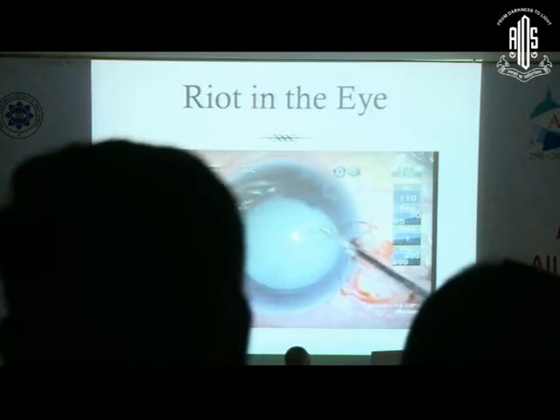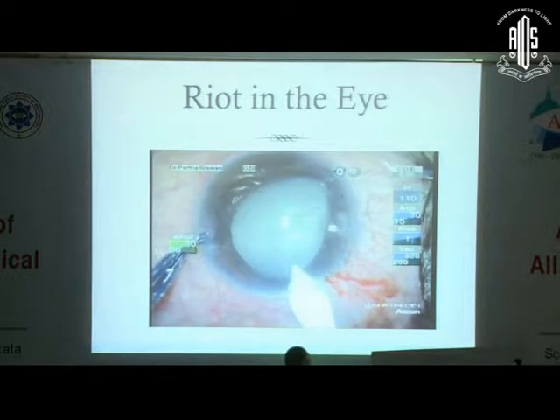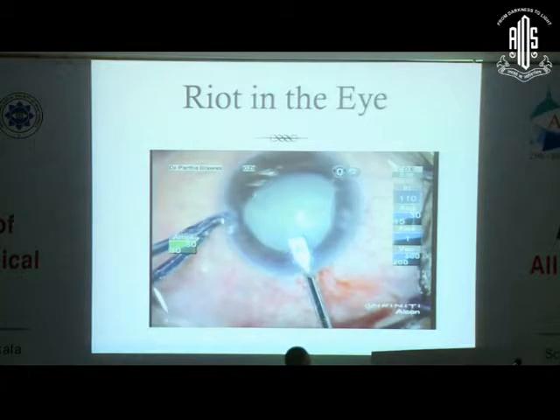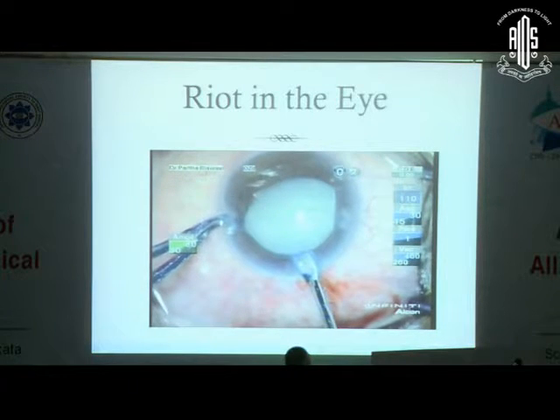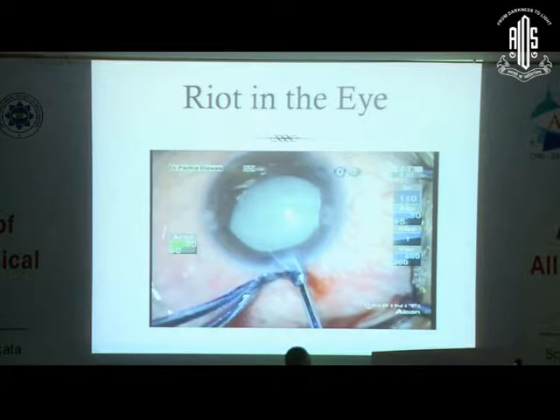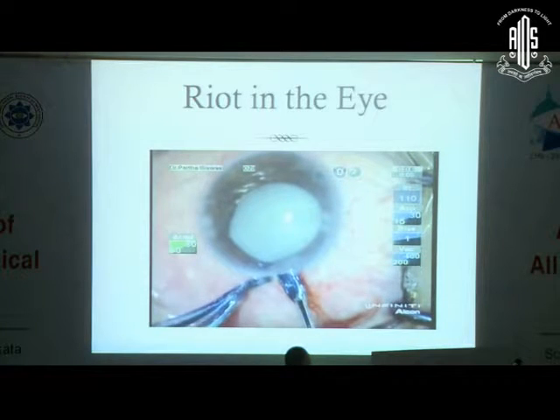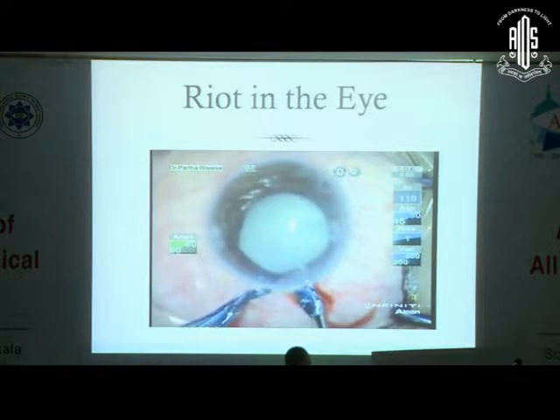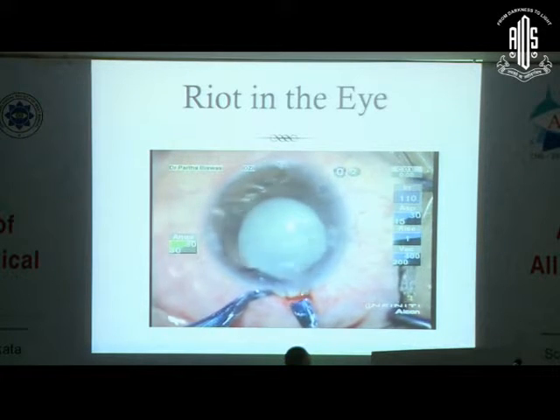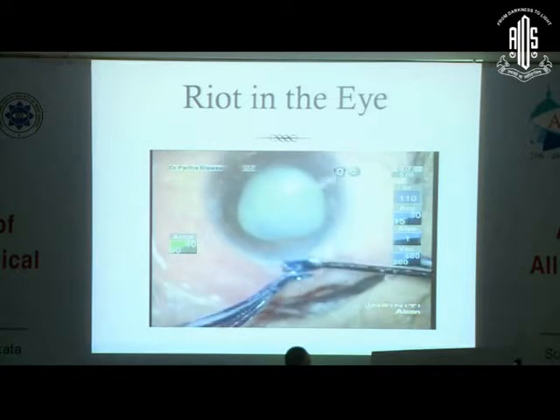Removing the synechia from the surface of the ICL was not so difficult. The next part was also manageable — I floated up the ICL with high molecular weight viscoelastic between the ICL and the anterior capsule. One of the ICL foot plates was then lifted and I grasped the foot plate with a very special forceps made by the manufacturer, which is both the implantation loading forceps and the removal forceps. A hand-over-hand technique is followed and the ICL comes out very nicely.